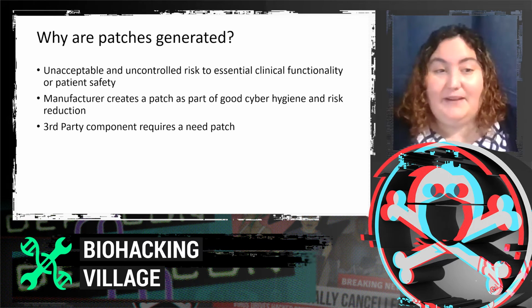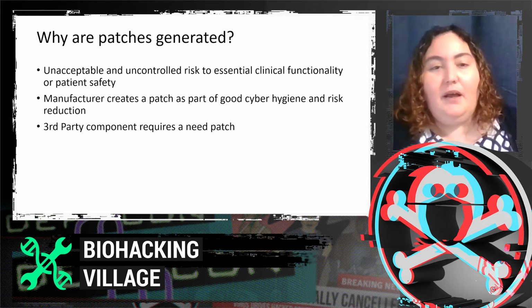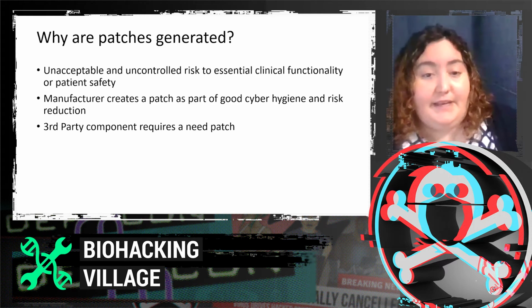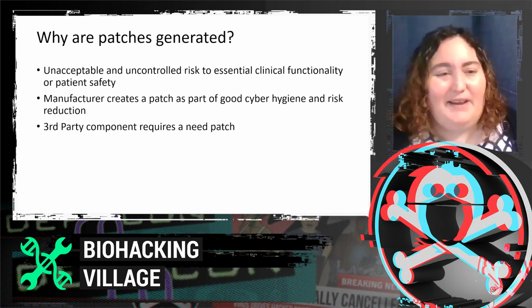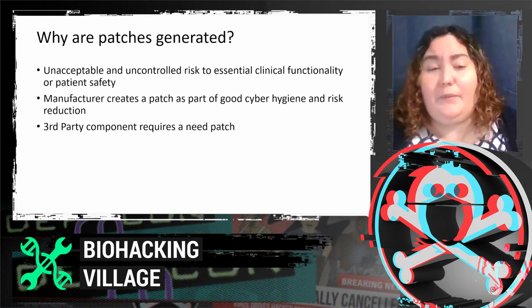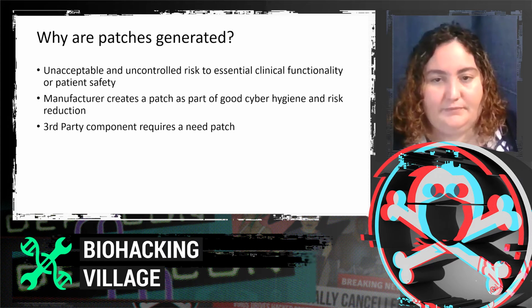Well, sometimes it's because there's an uncontrolled risk that has an unacceptable risk to either clinical functionality or patient safety. Sometimes it's just maintenance or part of good cyber hygiene. And sometimes it's that a third-party component requires a patch.